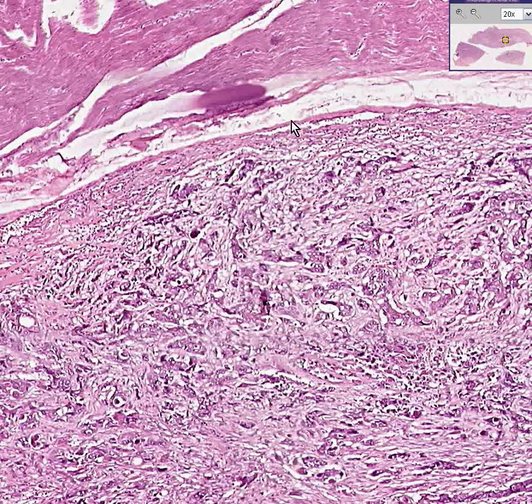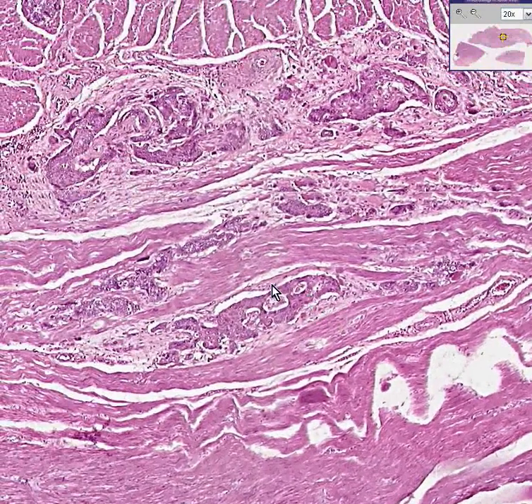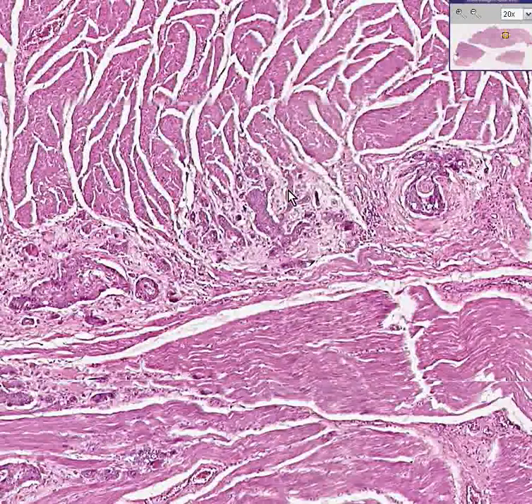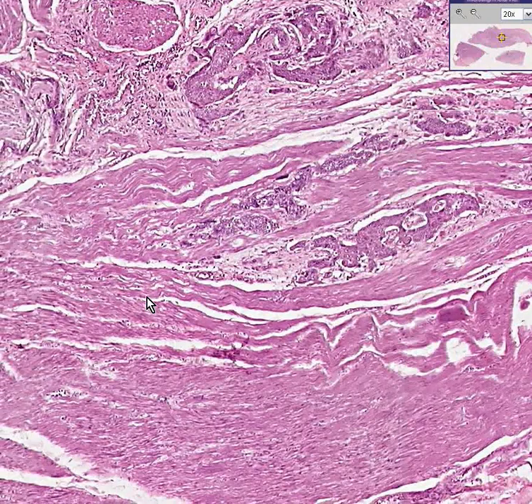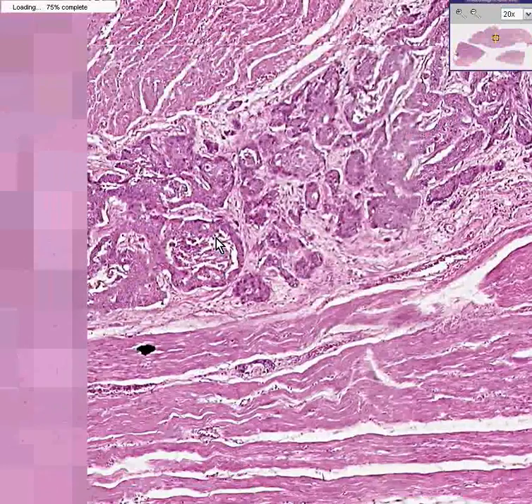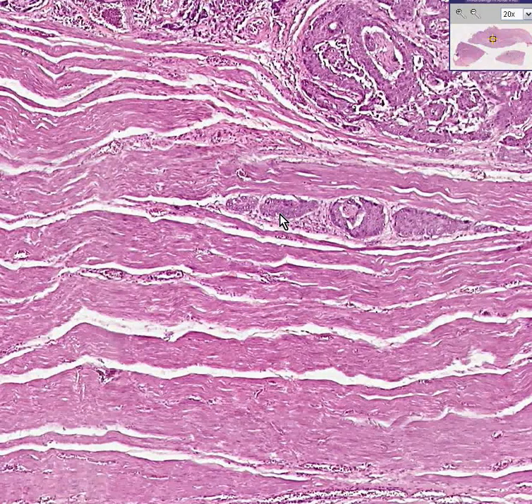It's not the best stain in the world, but all this tissue out here certainly doesn't form glands. You could also see it here within the muscle, and here as well — this is esophagus even though we may not have seen the origin. And look at this: it looks like it's surrounding a little nerve, perhaps, out here in the submucosa — perineural invasion. All of this bluer stuff is cancer. Here's a little nest in the deep muscle, also looking very squamous but also very malignant.